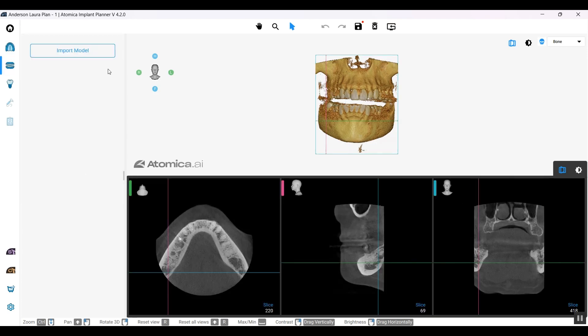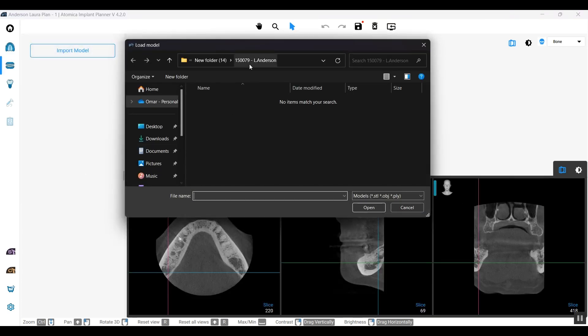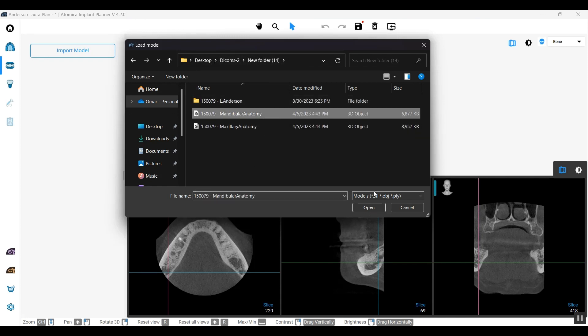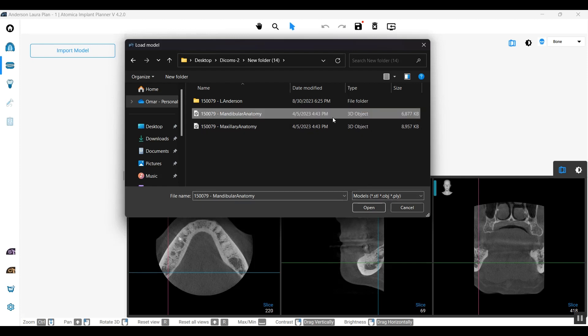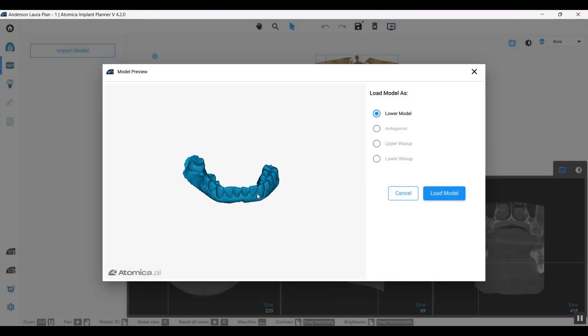Let's go ahead and import our model, our STL file. We're going to select the required file, which is the mandibular anatomy. As you can see, we support STL, OBJ, and PLY, all the 3D formats available.